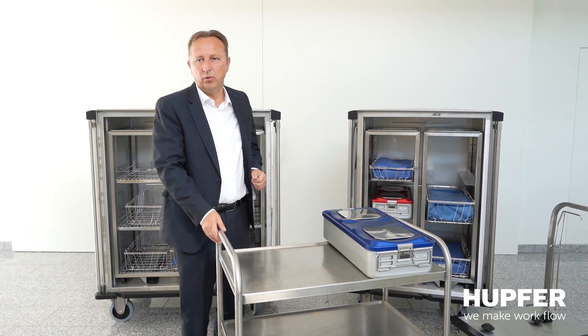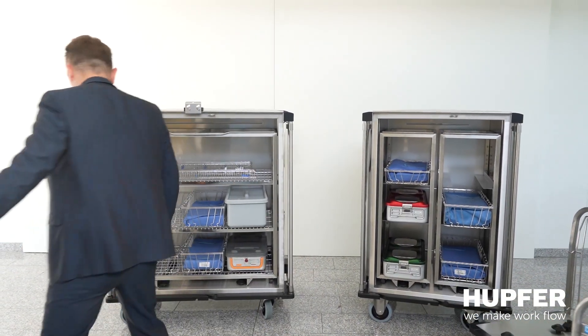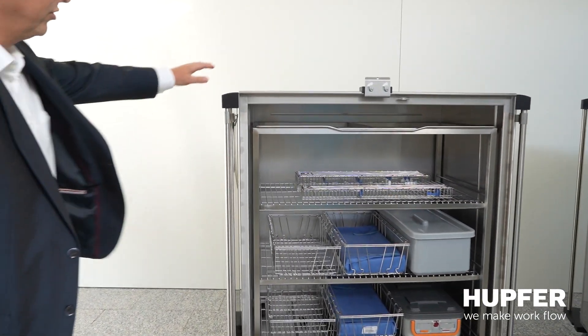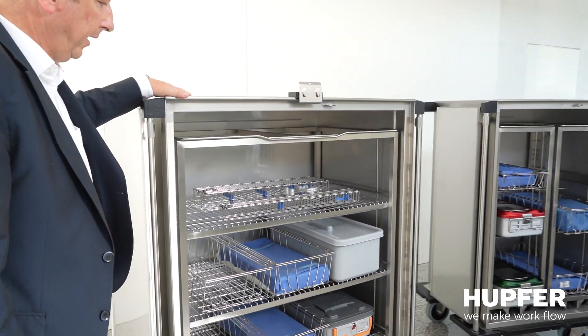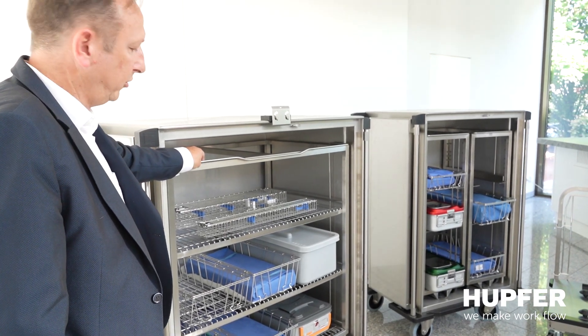What are the components of the system and how does it work in general? The HUPFER Kangaroo system has a closed transportation cart and a push-in rack which can be easily removed from the trolley system.